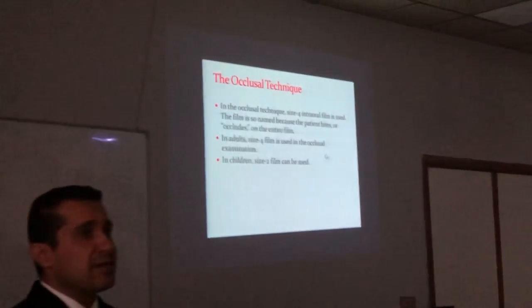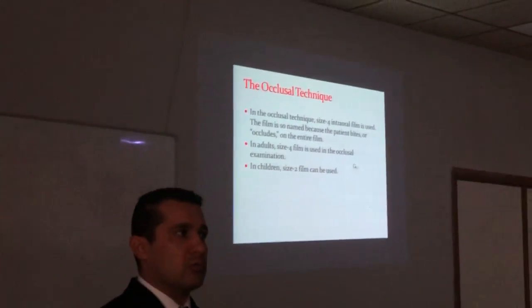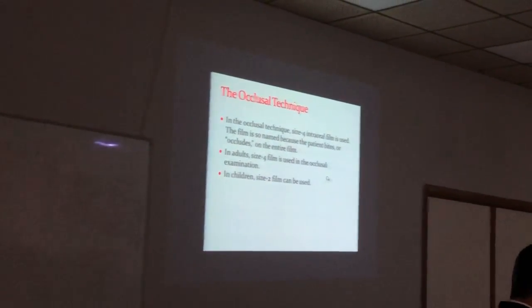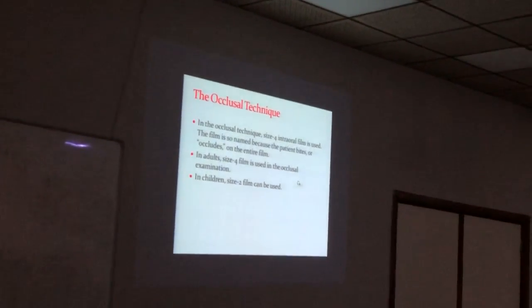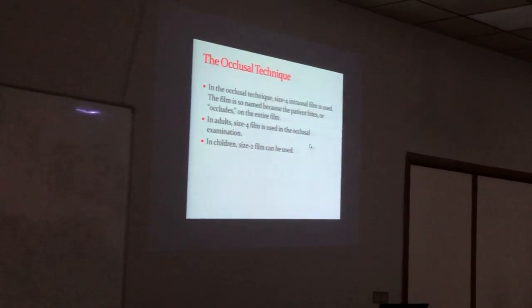The patient will bite on the film. There are no wings to bite on, just bite on it. يعني البيشنتس اللي راح يعض على الاوكلوزال فيلم كلياتا، واحنا ناخذ اشعه ماكسيلاري والمانديبولار.